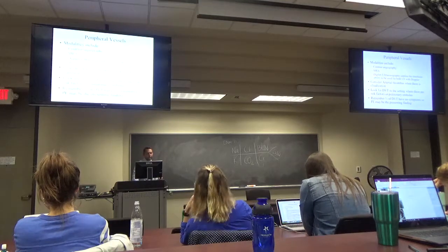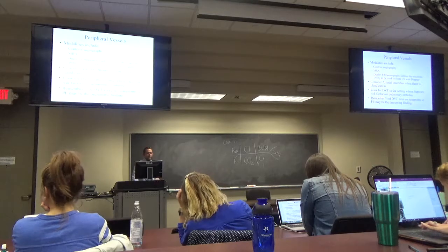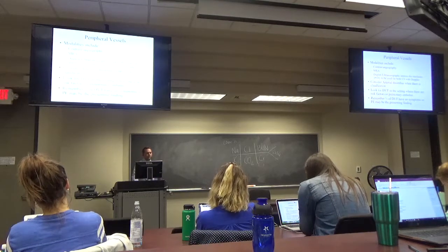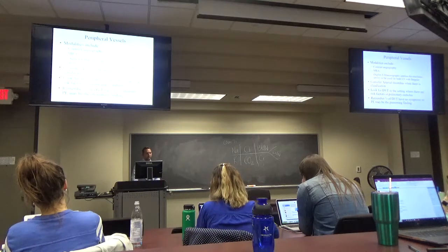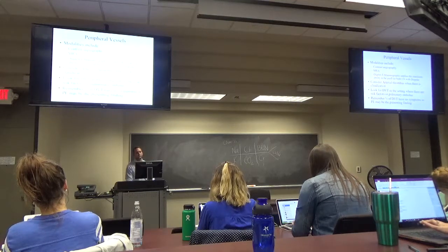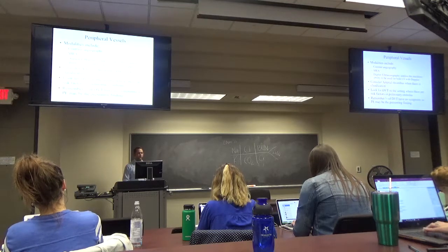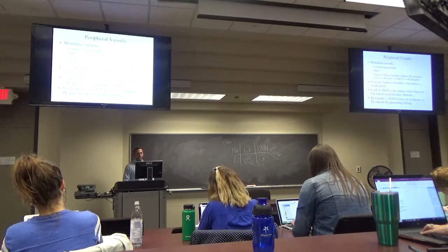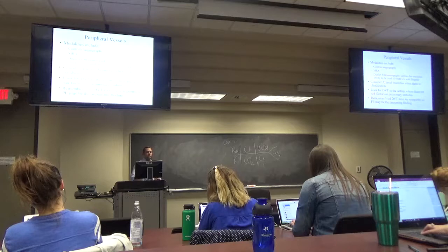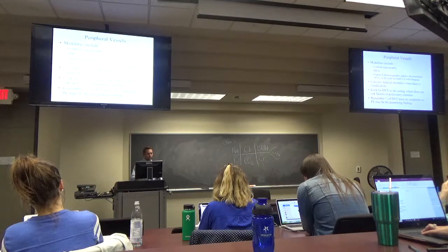So for peripheral vessels, it's a combination of things, but most of the time you're using ultrasound. When you're looking at vessels, you want to see if they're patent. You're worried about a DVT. You're worried about significant arterial stenosis. You usually start with ultrasound because it's non-invasive and you can get a fairly accurate study, and then from there, if you see a significant stenosis, you'll know whether to go to contrast angiography or magnetic resonance angiography.